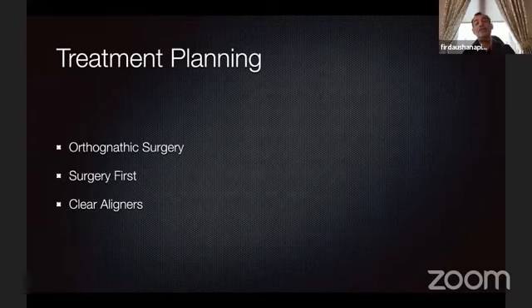The other thing is that if we were doing orthodontics for him now, when he goes overseas, perhaps this is going to be a management problem, because if he was doing braces, we would have to get supervision from the overseas doctor where he's attending university. And that could be a problem in terms of cost and treatment planning. With clear aligners, we can actually start off fast and finish it. We can automate as much as possible before he goes overseas.